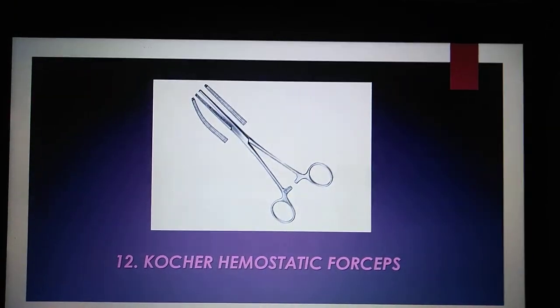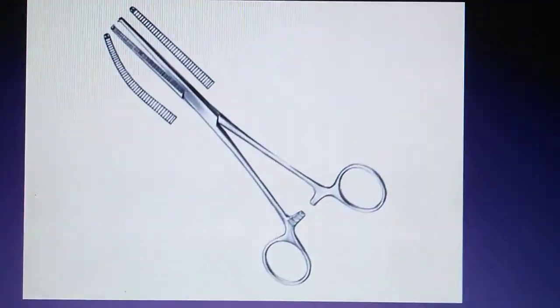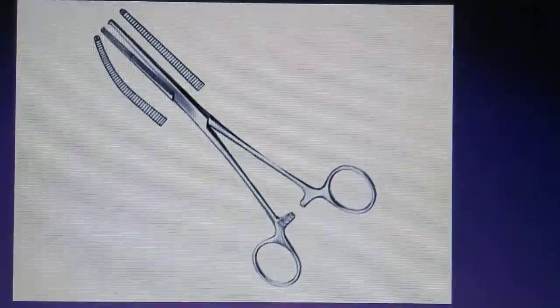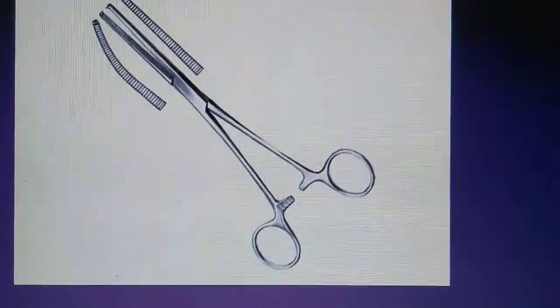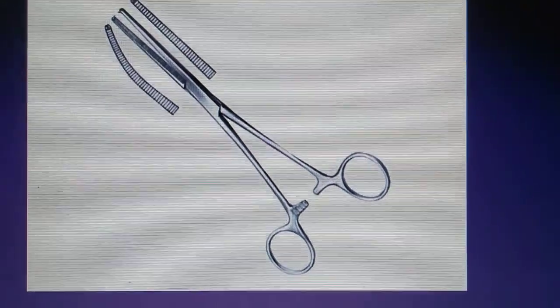Kocher Hemostatic Forceps contain 1x2 teeth on straight or curved jaws to avoid slippage when trying to grip arteries.